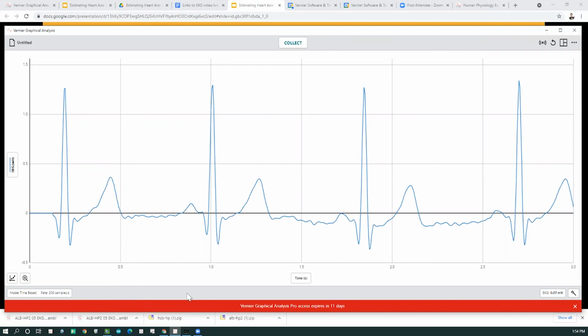John, do you recommend any type of skin prep prior to placing the tabs? No, but you can. It's a really good thing that you bring up. I have really good skin conductivity, so I get EKG traces to work on me all the time. There is a small percentage of people that it'll be hard to get a good EKG trace on.